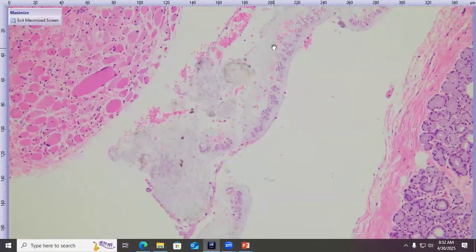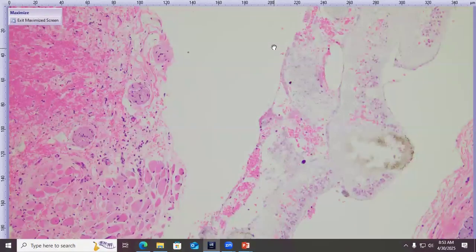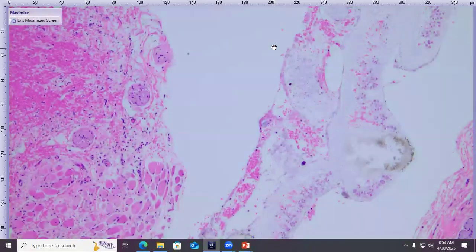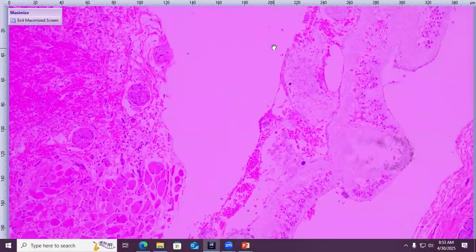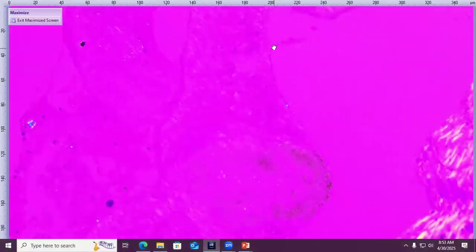Let's see if I can. Oh. Is that in already? Okay. Yeah. To the side. See if I can. So they're the other. I don't know which one it is. Put that in the middle again. Oh, in the middle. Yeah. Okay. Oh, actually, nice collagen. Nice collagen. I can focus that at all. A little bit.